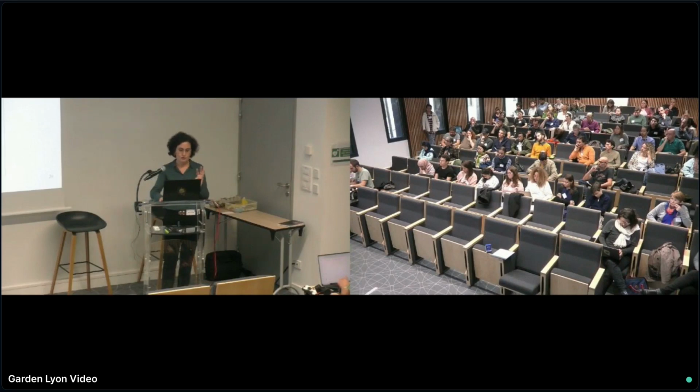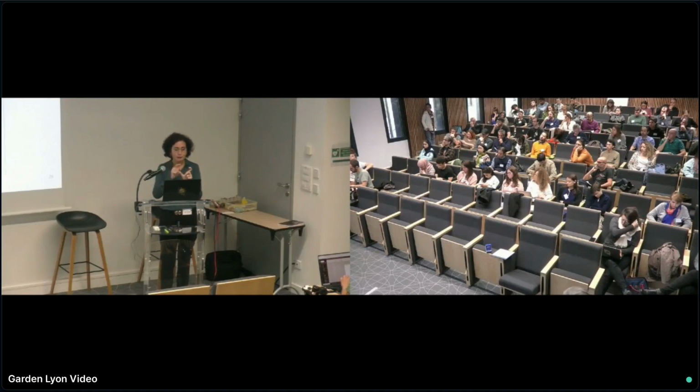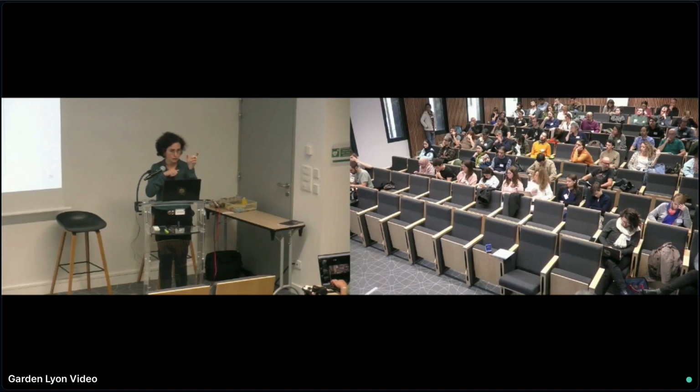So I should first say that I didn't run the analysis myself. I know quite a lot of details about it, but I'm not super expert of this deep learning yet. I'm trying to learn. So essentially what we do, we have these recordings of 8 and 20 minutes. Then we epoch the recording. We have 5 seconds epochs, and the deep learning works on the 5 seconds. So at the end, we have a confidence that is assigned to the 5 seconds. And for the patient, we take the average of the confidence that is obtained on the 5 seconds epochs.